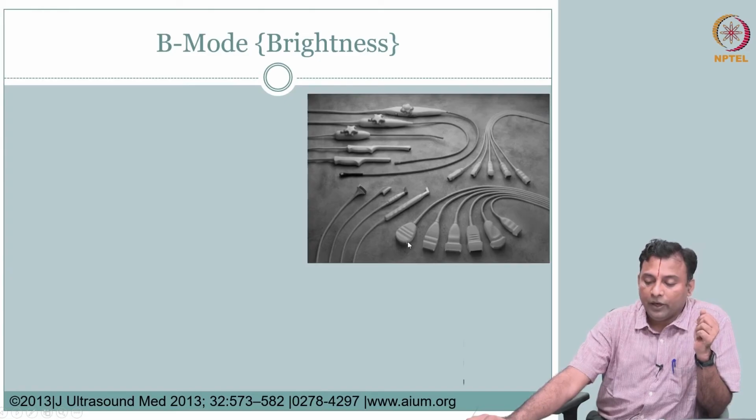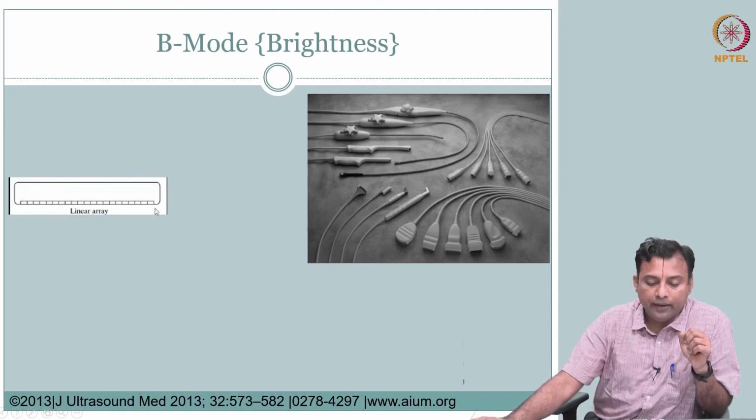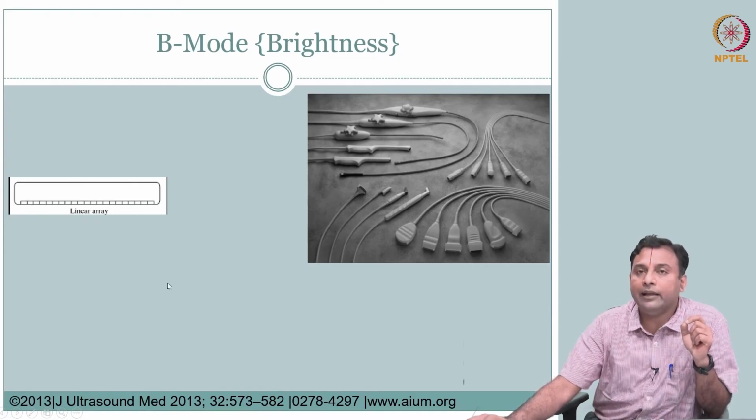Predominantly, what we will cover in this course is the underlying concept of how an array is used to form an image. We will not go into detailed application-specific transducers. We will cover generic ones, for example, the linear array, where elements are positioned next to each other along a line. These are different piezoelectric crystals, independent crystals placed next to each other in this linear array form.